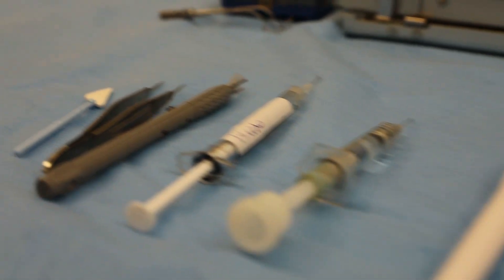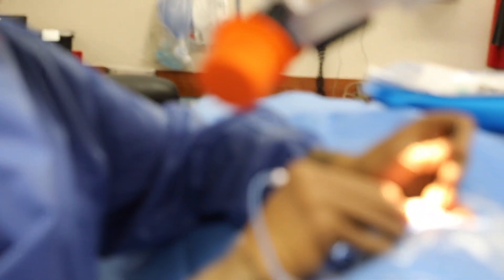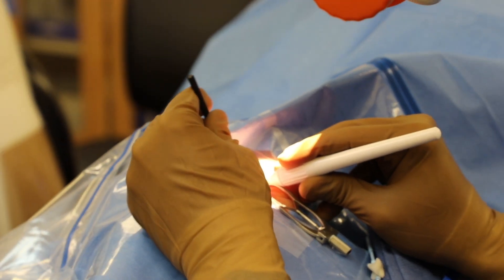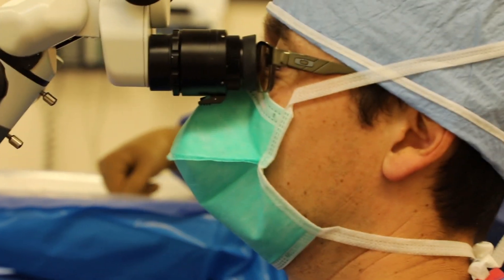I don't find it necessary to use pilocarpine post-operatively. I don't believe that it increases the ability of the cleft to stay open. After the procedure, the patients are generally very comfortable. If any pain medication is needed, it's usually simply Tylenol. They're very comfortable the day after surgery and during the post-op recovery period. I found the procedure to be relatively easy — it's kind of a standard gonioscopic and angle-based surgery. I found the addition of the irrigation aspiration to be an excellent addition to the procedure, and it combines very well with phacoemulsification or can be used as a standalone procedure.